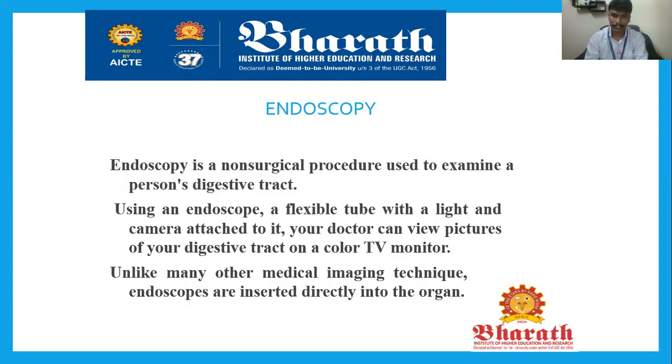Endoscopy is a non-surgical procedure used to examine a person's digestive tract. Nowadays, endoscopy is widely used for all applications, but it was proposed mainly for examining the internal architecture of the human body's digestive tract.